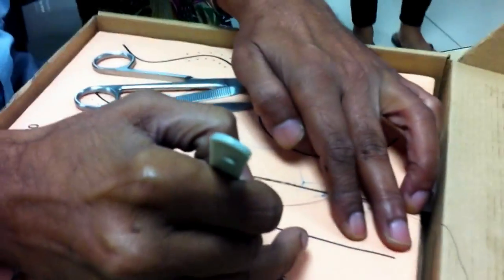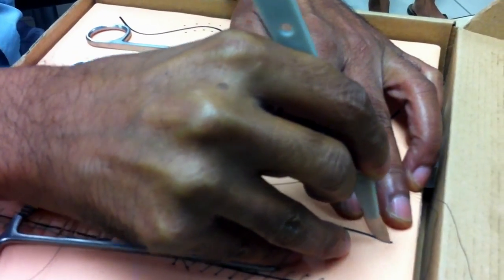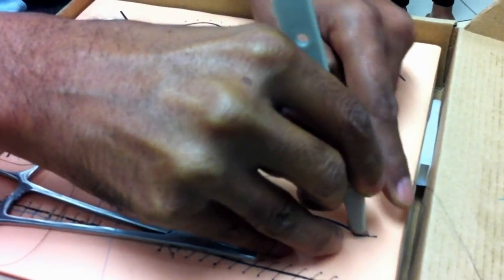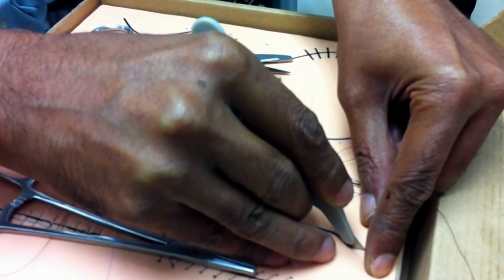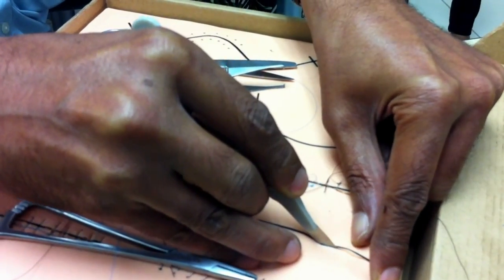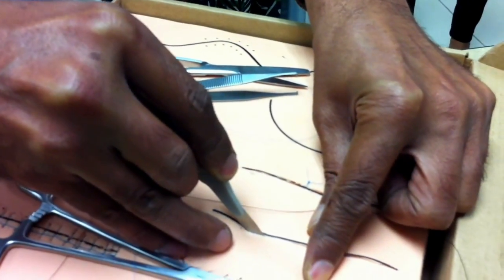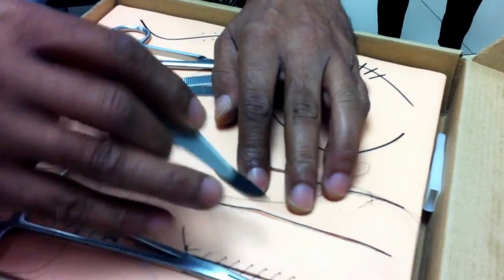Suppose this is the place where we want to make the incision. The angle of the blade to the skin should be 45 degrees. Go first straight in, and then bring it to 45 degrees. You have to have a steady hand for this, no essential tremors. Go straight across. Give a little traction with your other hand, and with gentle pressure, continue right down. I made the skin incision.